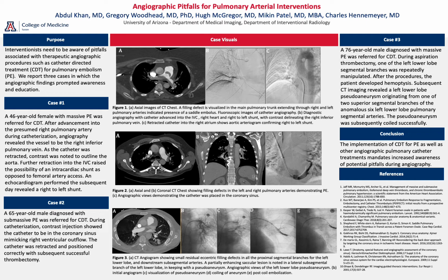It's important to note this potential pitfall, as any sort of injection, such as a bubble or other abnormality, may actually go into the systemic circulation and cause a stroke. The second pitfall we discuss is access into the coronary sinus.